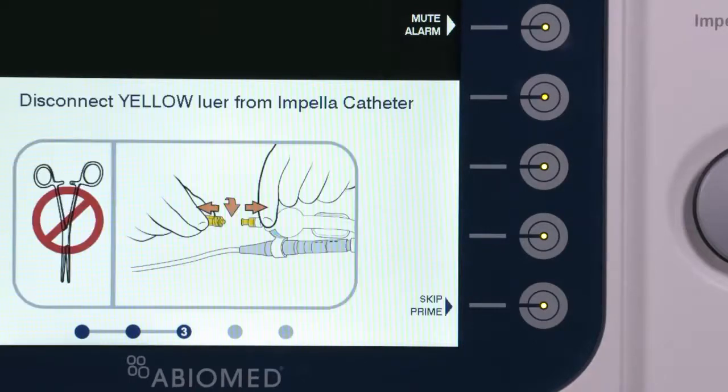If preferred, the Skip Prime button can be pressed to avoid priming the tubing with the new Purge Fluid and complete the Change Purge Fluid Bag procedure.